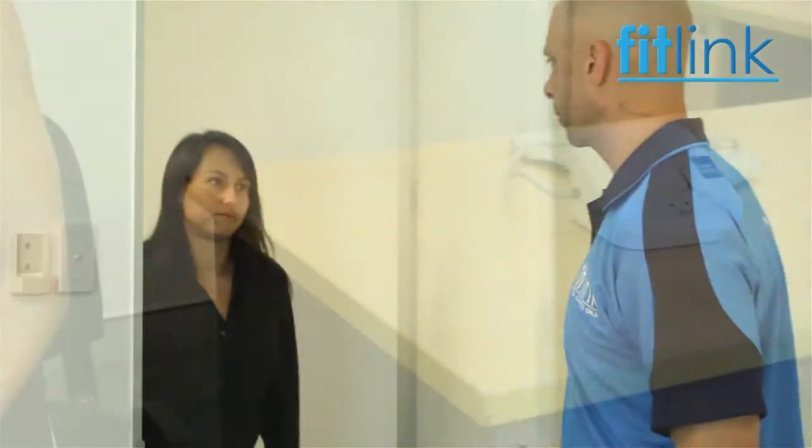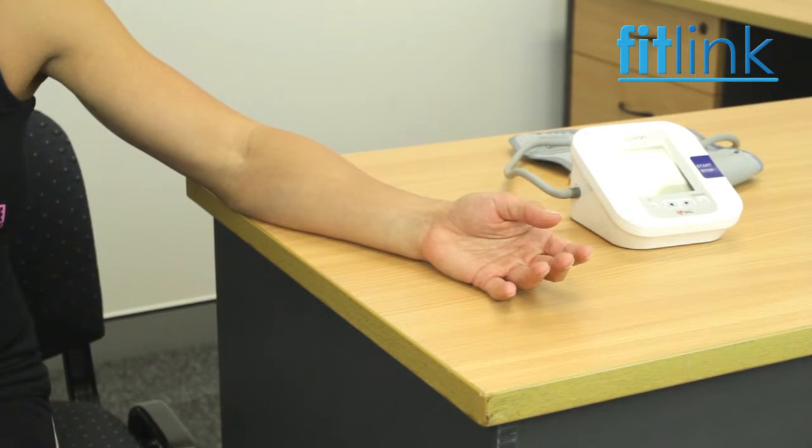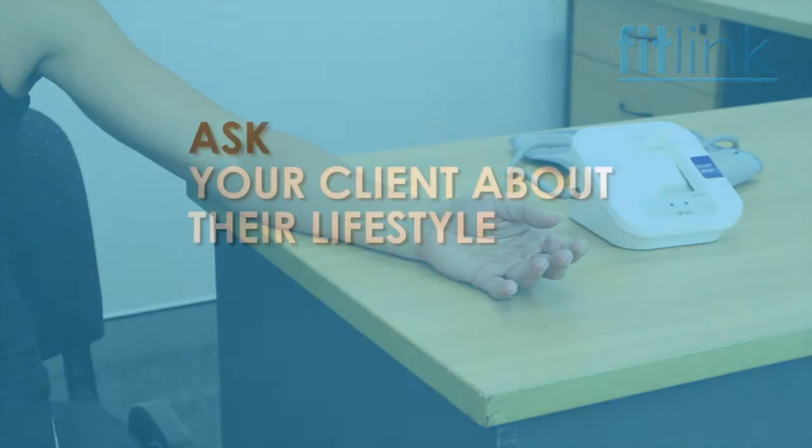When assessing the client's blood pressure, have your client seated in a comfortable chair with their left arm resting on a table or a solid surface, and the upper arm at heart level.